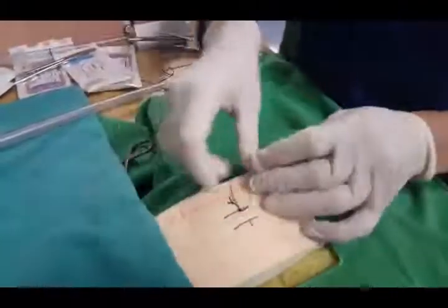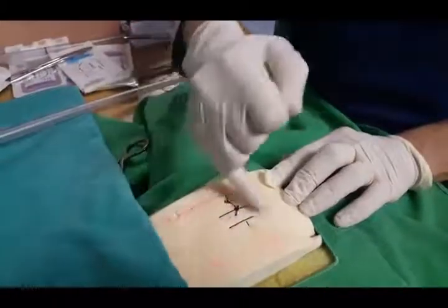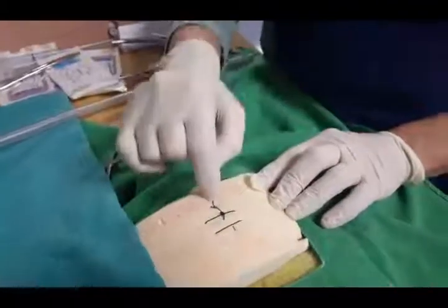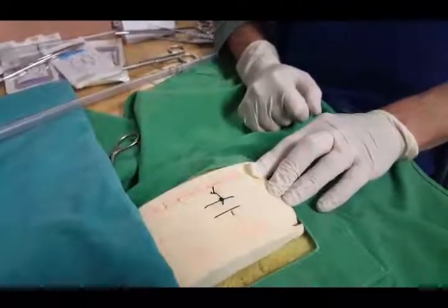And there you go. That's pretty much it — that's your u-shape suture, and that's your vertical mattress suture. One through the center and one keeping the peripheral aspects of the incision together. Does that help a bit?